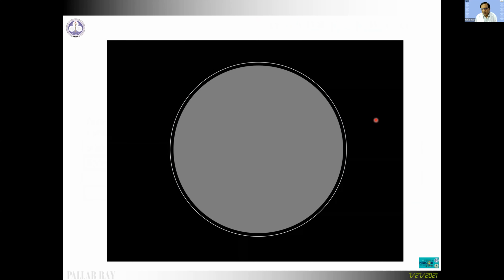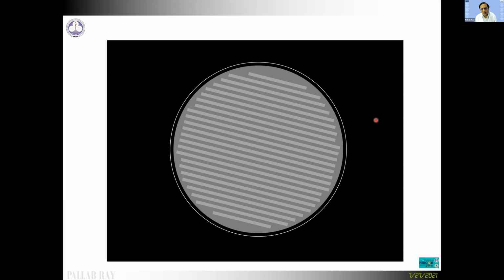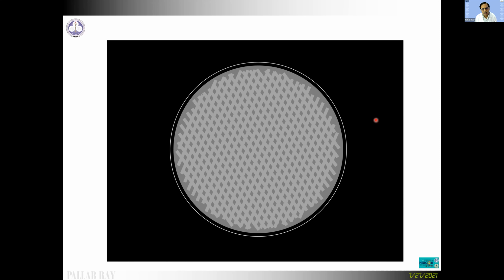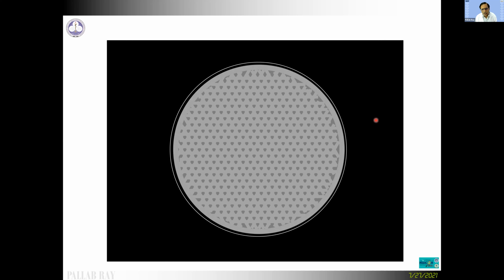Now we take the plate which has been dried, hold it with one hand, and with the other hand we make the inoculation in a horizontal incremental way. After that, we rotate the plate by about 60 degrees. Then again we repeat the same incremental inoculation from above downwards, side to side. Again, rotate the plate by 60 degrees and repeat the same thing. We do it 3 times, rotating by 60 degrees, because it gives you a homogeneous lawn culture.